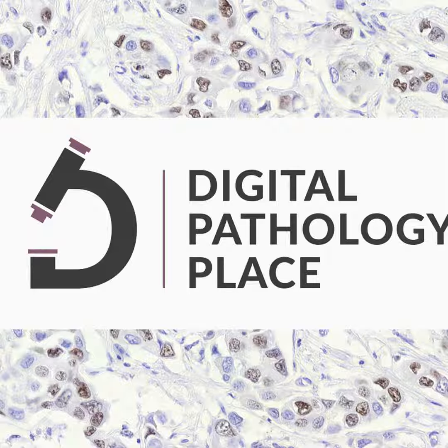But on the other hand, people have looked at this in the digital pathology literature, and some of it is intuitive, right? We know that there are some features that you need to focus up and down to get really confident about. That made sense with the cases that we saw that were challenging in both modalities. So, fine chromatin features, dysplasia versus atypical nuclei, things like that.